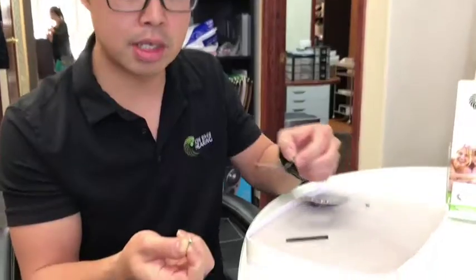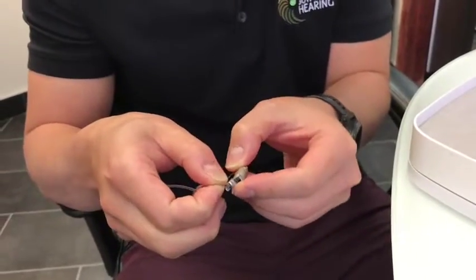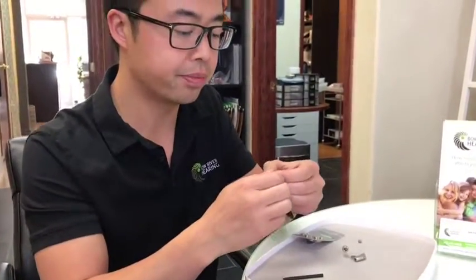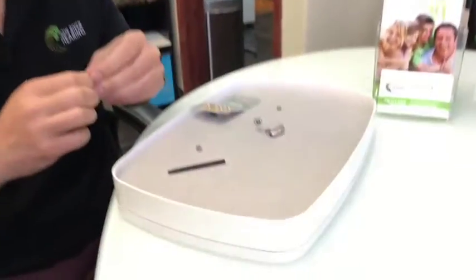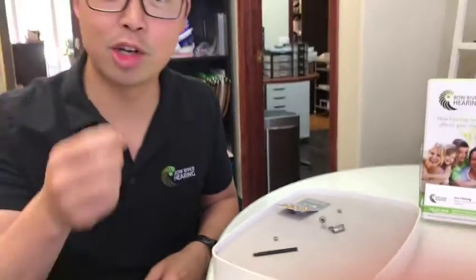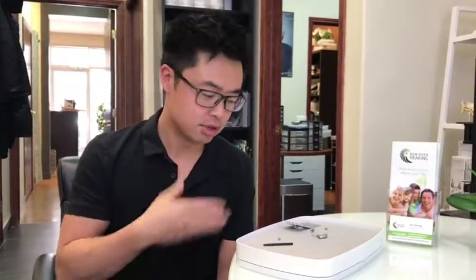There are two ways to do this. Some patients like to just pop the battery right in and then pull the tab off, but what I'm going to show you today is taking the tab off first. One thing we like to say is it's good to leave it out a little bit — like a good wine, let it breathe. The way these batteries work is that once it touches air, that's how it gets activated and starts. So, like a good wine, let it breathe for a little bit.